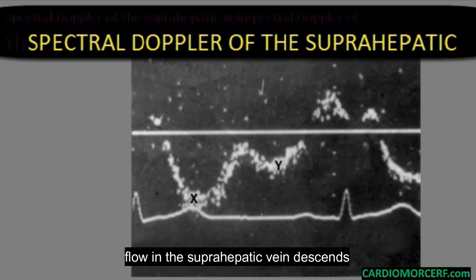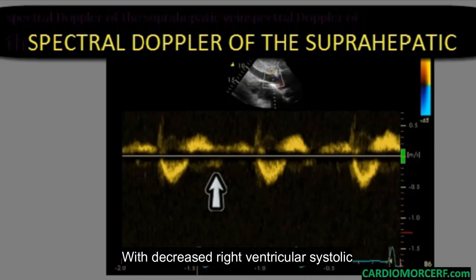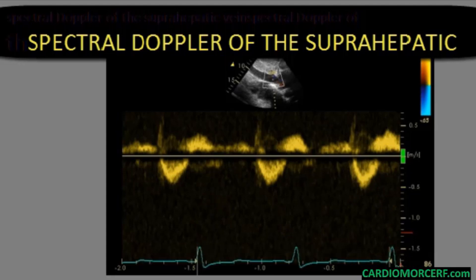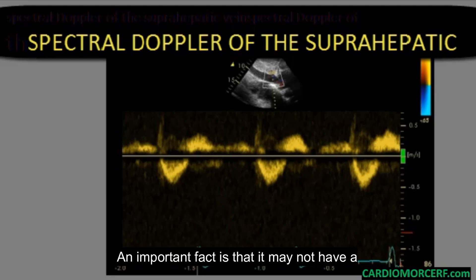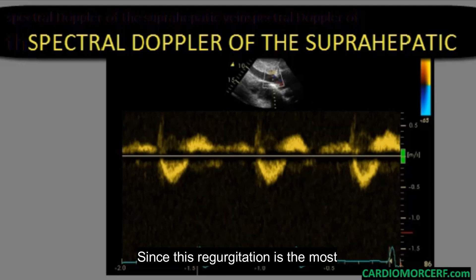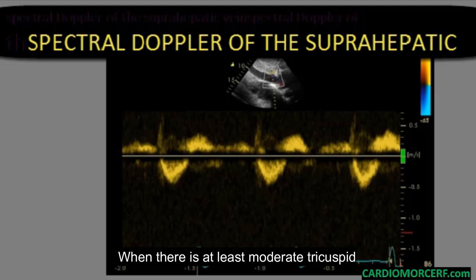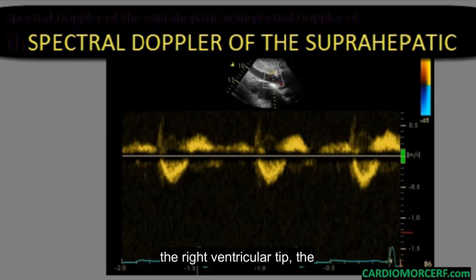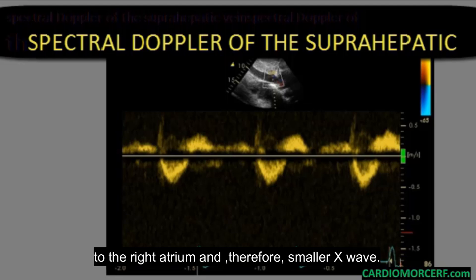With this piston effect, flow in the suprahepatic vein descends toward the inferior vena cava and right atrium. With decreased right ventricular systolic function, this piston effect will diminish. As seen in this case, the X wave is well reduced — smaller than Y and almost non-existent. An important fact is that there must not be tricuspid regurgitation in this evaluation, since regurgitation is the most common cause of X wave reduction or even its inversion to a positive deflection. When there is at least moderate tricuspid regurgitation, although there is the piston effect pulling the atrial floor toward the right ventricular apex, the regurgitation increases right atrial pressure, which decreases blood entry to the right atrium and therefore produces a smaller X wave.